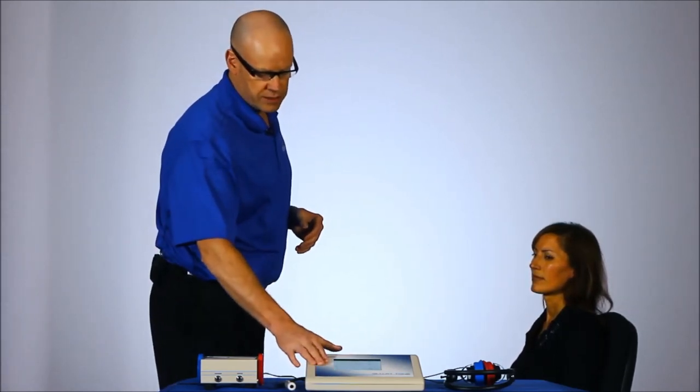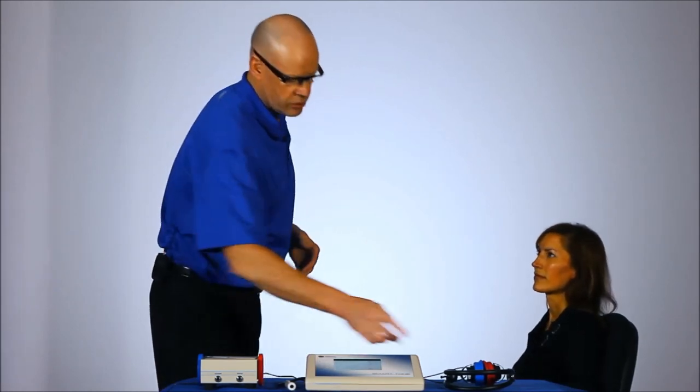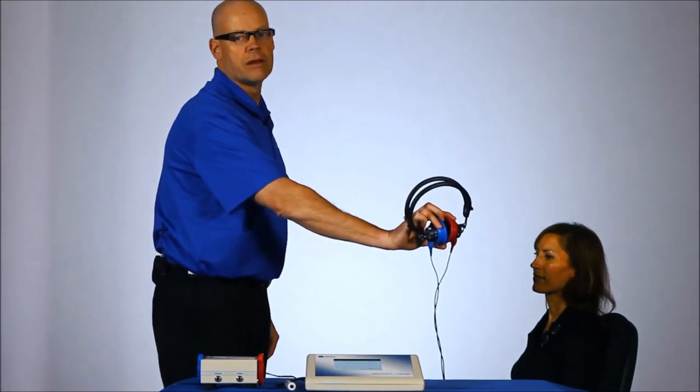As well, if she's in a sound booth, for this example we're not using a sound booth, but if she was in a sound booth, which is highly recommended, this audiometer comes with a full talk-over feature so I can pause the test and outside of the sound booth, I can be talking to Delia, re-explaining it to her. She'd be hearing through the headset itself.